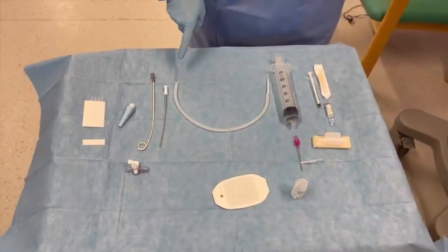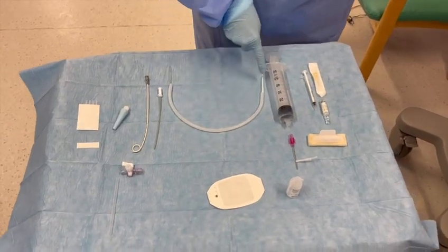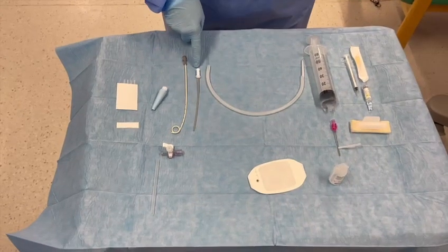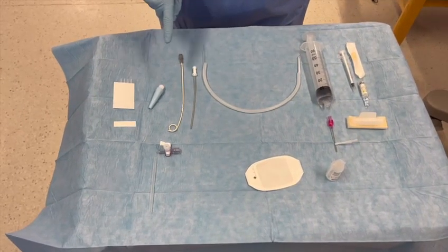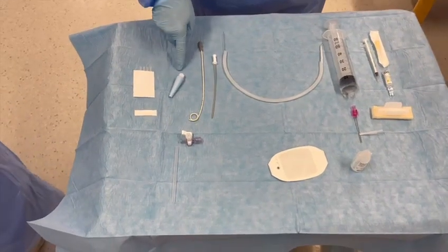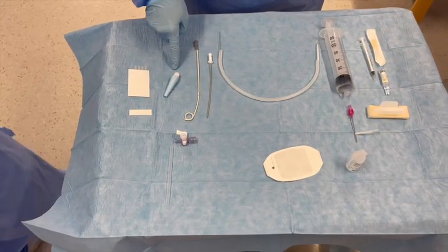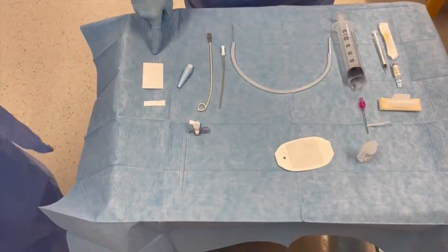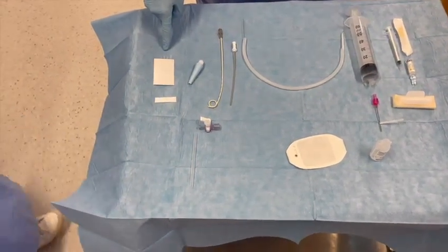The guide wire, which will be threaded through the needle into the chest in preparation for the dilator. The dilator will be used to dilate the skin site. Use appropriate size pigtail catheter for the infant's weight. Spigot is used to connect the catheter to the drain. Steri strips and tegaderm are used to secure the catheter in place.